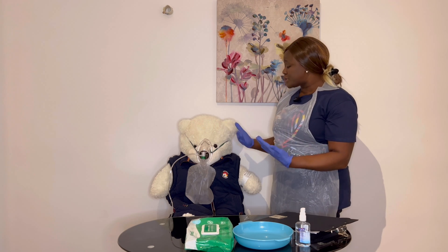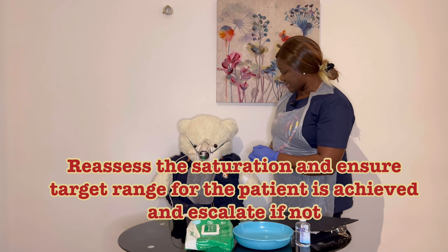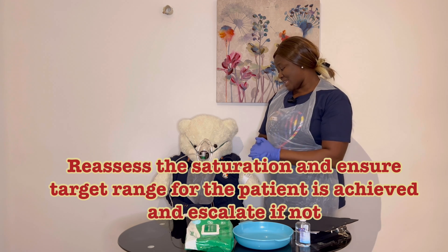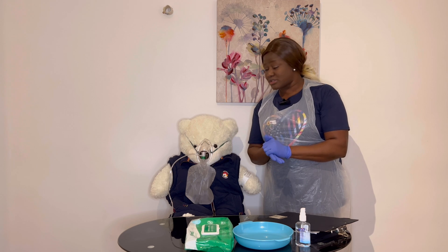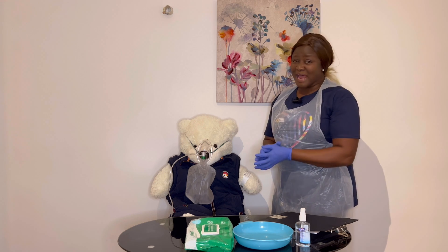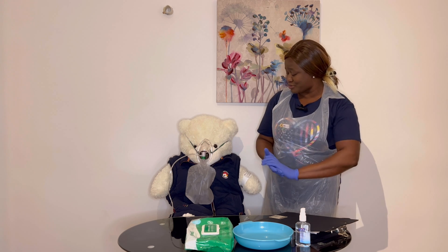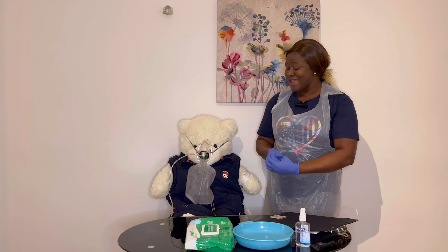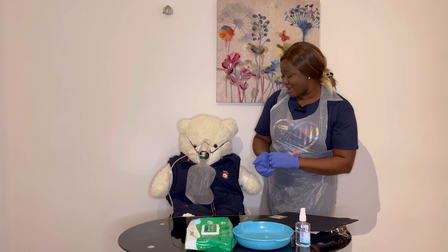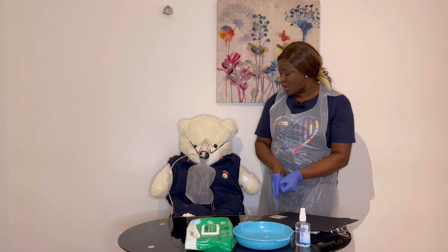I'm going to do a regular check of your oxygen level using the oxygen probe. We'll make sure you attain the target of 94 to 98%. If the target is not achieved, this will be escalated as appropriate. Please make sure you do not use any petroleum-based moisturizer on your face at this time — this is not safe during oxygen therapy. Are you happy? Can you breathe better? Do you feel a good improvement in your oxygen? Wonderful. I'll be around for the next 30 minutes to check on you.